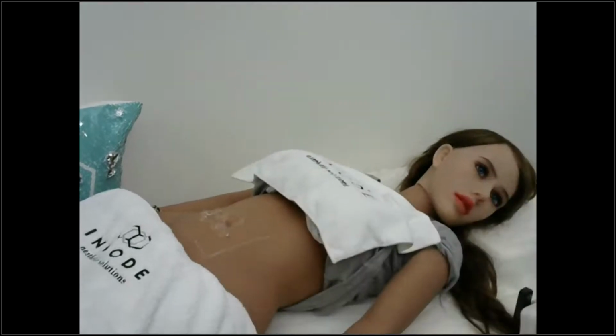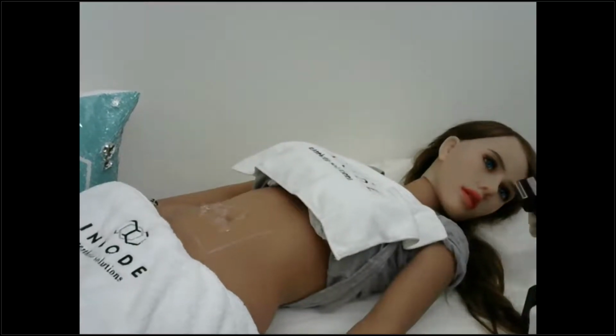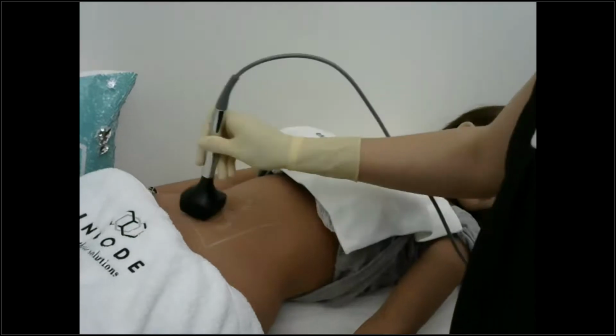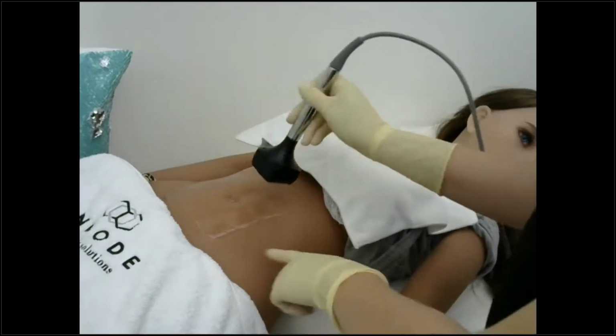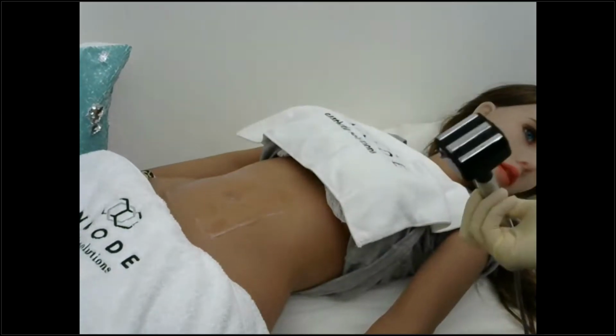And I'm going to spread it around. You can either use a spatula, a wooden spatula, or you can use the applicator. Personally, I like using the applicator. So I'm going to spread the gel around. Again, if you think you're going to have to use some more gel during the treatment, you can apply a little bit of reservoir on the sides and the adjacent area.